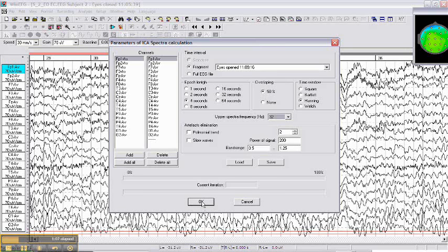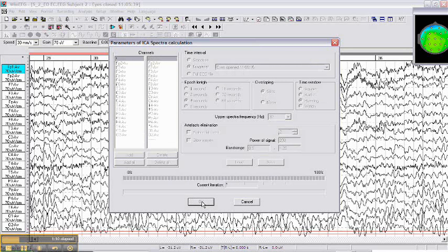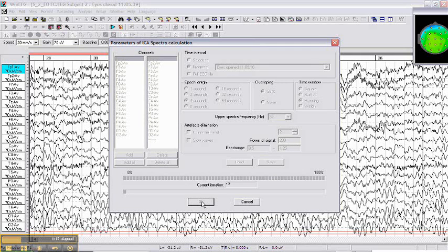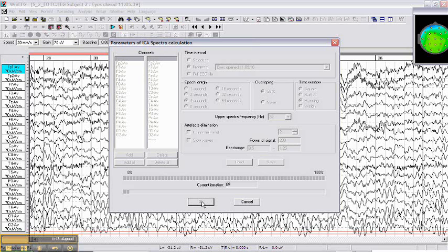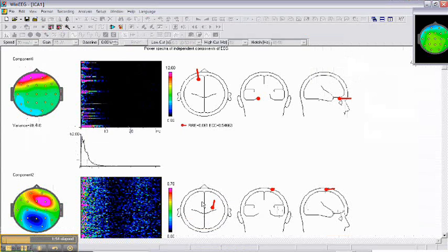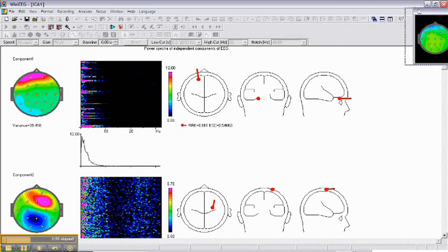In this case the software will decompose EEG in eyes open condition into independent components. For each independent component, the program will compute spectra for each four second time intervals and shows the dynamic of this spectra over three minutes of recording. Then you can get the whole impression of what are the components that can be separated in this patient and how they change in time.